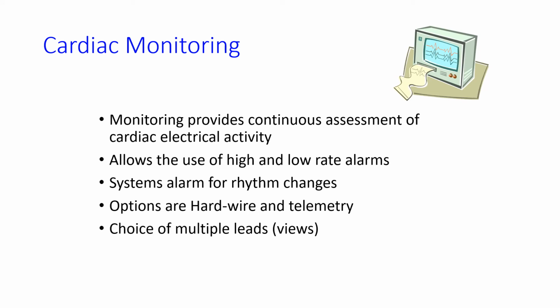With cardiac monitoring, the reason we do it is that it provides a continuous assessment of your cardiac electrical activity. I cannot emphasize enough that you are only looking at electrical activity. You cannot see or feel a pulse just by looking at a monitor. There are rhythms where you could potentially have electricity or normal looking complexes, but not have a pulse. However, you can't have a pulse if you don't have electricity either. So you can have electricity without an actual pulse, but you can't have a pulse without electricity.